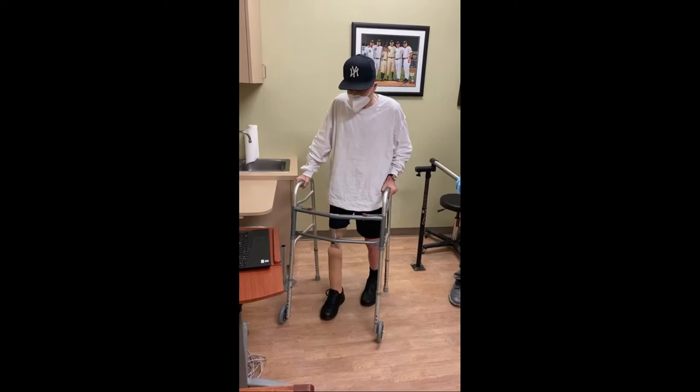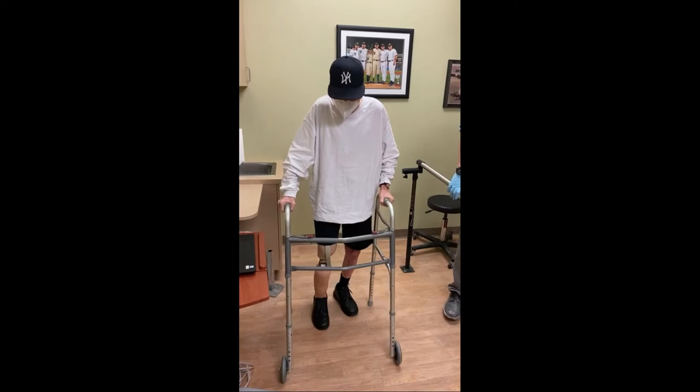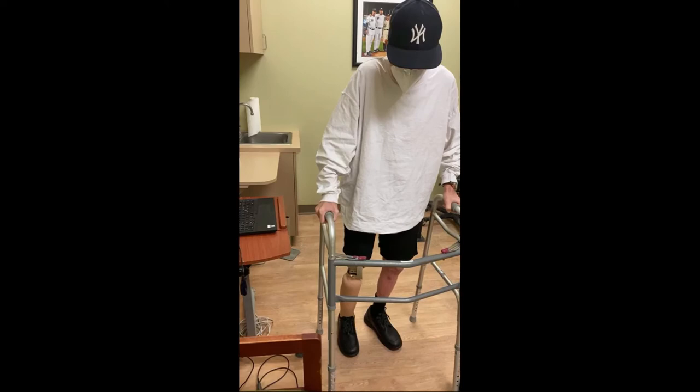Have you done stairs yet? No. You want to try? Yeah. You feel comfortable walking out in the hallway and walking through the steps? Yeah. So that was a big step. I'm noticing when you get overextended, that's when you kind of do a last step up to it. I want you to just step right past your right toes — short steps.